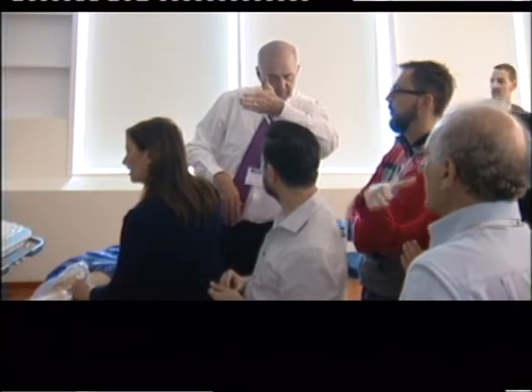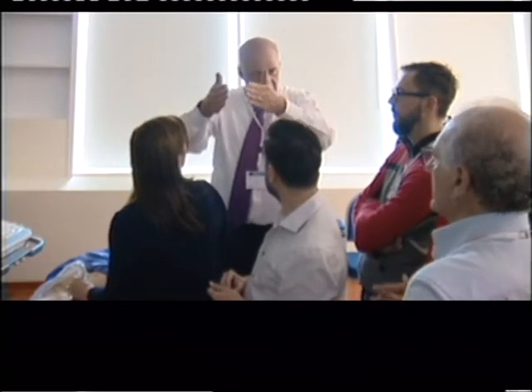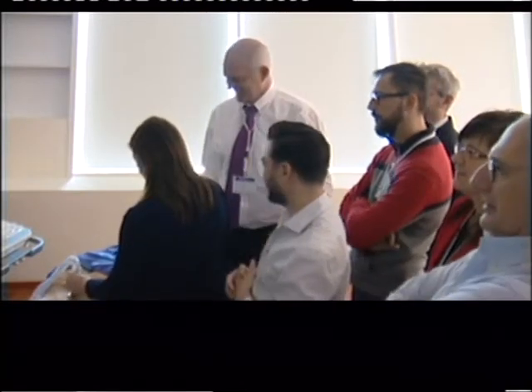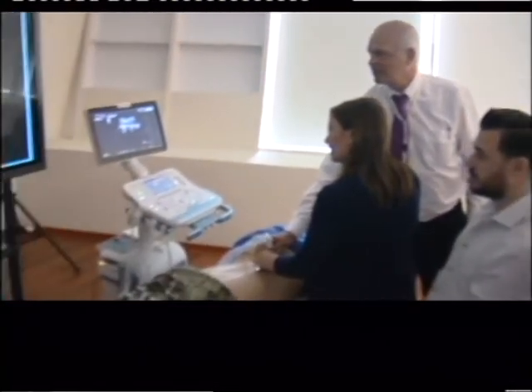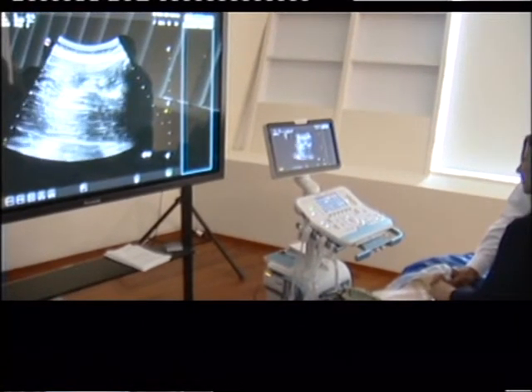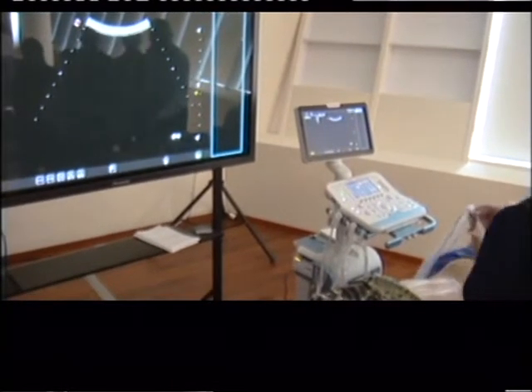You're kind of going wider on the bottom, because the lumbar plexus is going like that. It's more like a tree, a little tree. So facet is a little bit wider on the bottom. And now transverse process, and then there's lumbar plexus. Is that okay? All right.